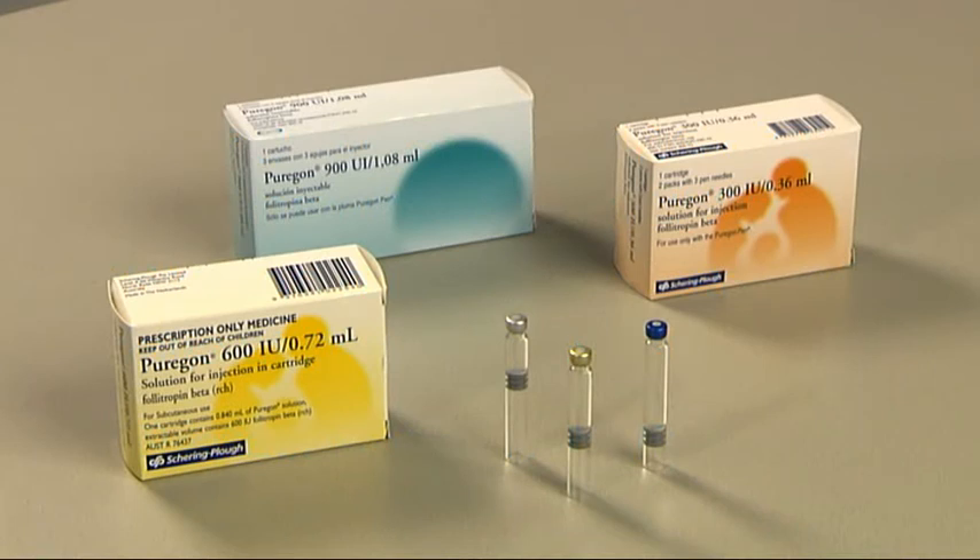Puragon cartridges are available in three strengths: 300, 600, and 900 international units of recombinant follicle-stimulating hormone, or FSH, per cartridge.